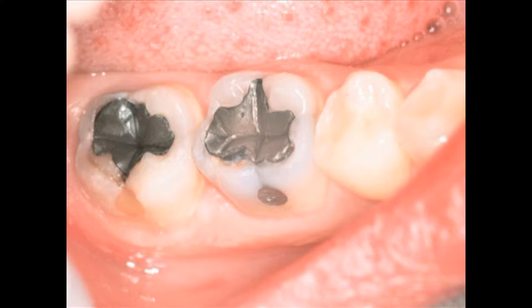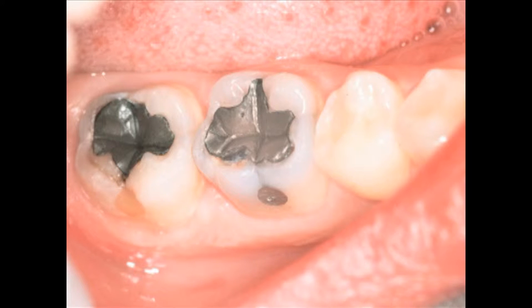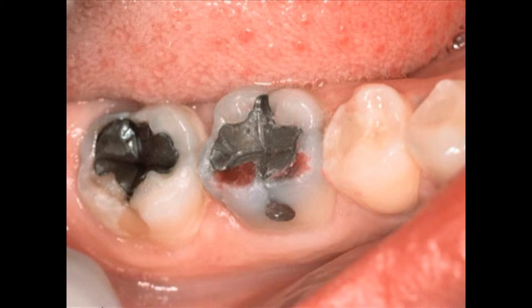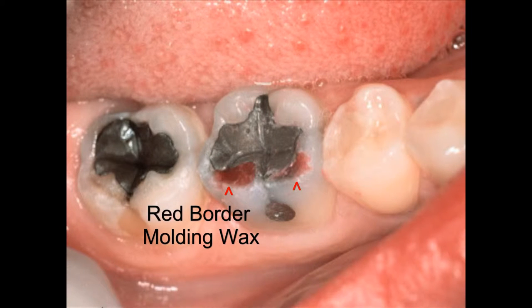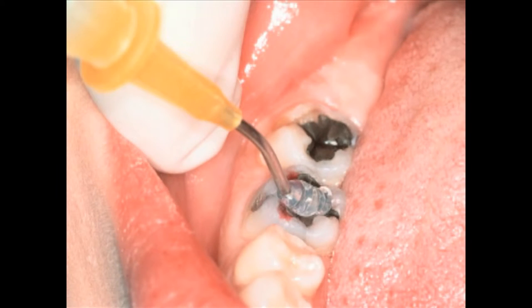Here's another common case: an old amalgam that's wearing out with caries on the cusp tips around it. It's defective and we want to replace it. We take some red wax and, with your glove finger, rub it on the tooth. The red wax gets caught in the defects and the marginal defects around this amalgam, so now your margins are filled with red wax.